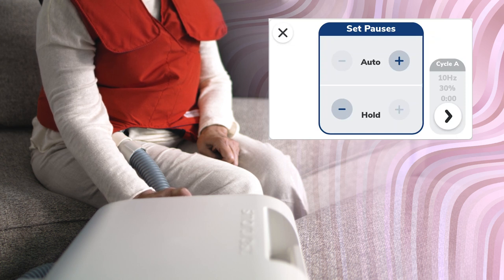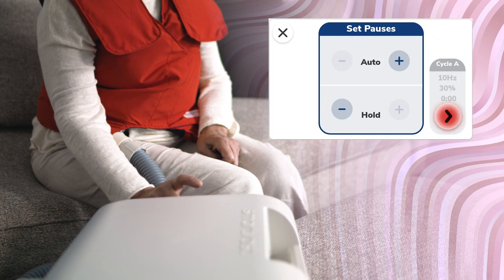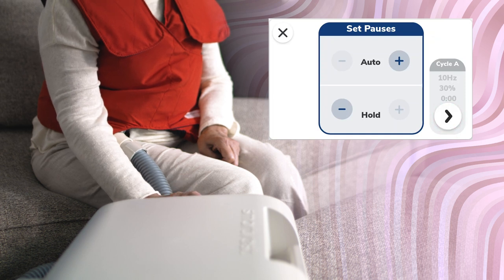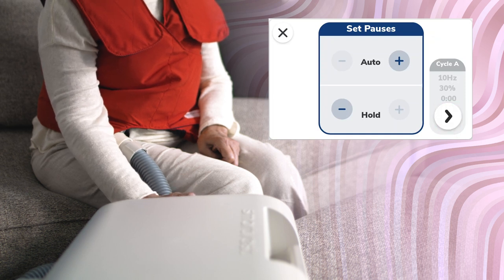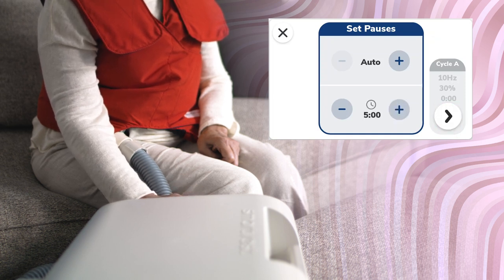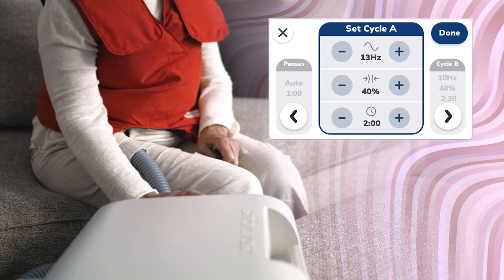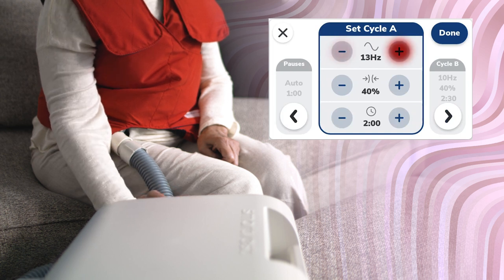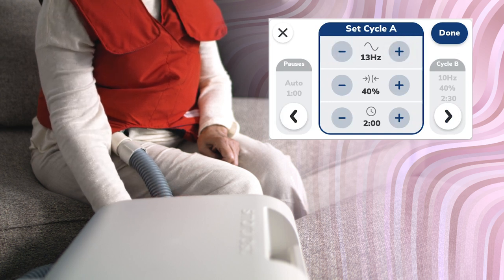After adjusting the pause selections, tap the next arrow to advance to the cycle selections. To adjust frequency for cycle A, tap the plus and minus buttons. Frequency can be adjusted in 1 Hz increments from 5 to 20 Hz.